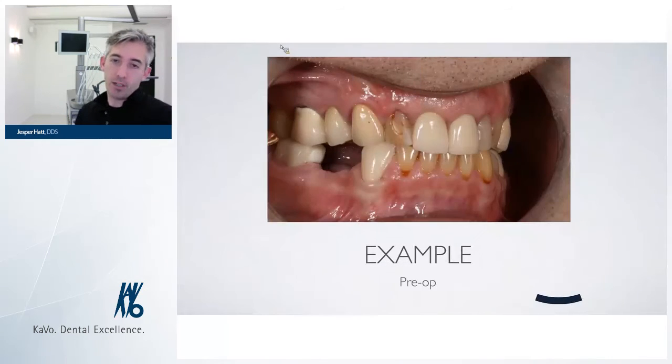So, an example of our implantation with the guided surgery. This was a patient that was referred to us for implantation of 2 premolars in the lower jaw. And here we have a possible problem with the soft tissue. We were able to do a flapless procedure, but we considered doing a flap procedure because of the bone and because of the soft tissue. As you can see, there's not that much space for a punching procedure. So that's another reason why we really like our photos.